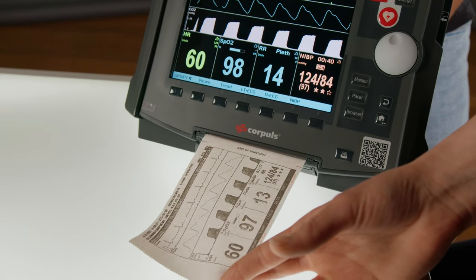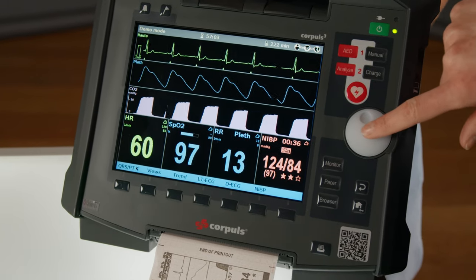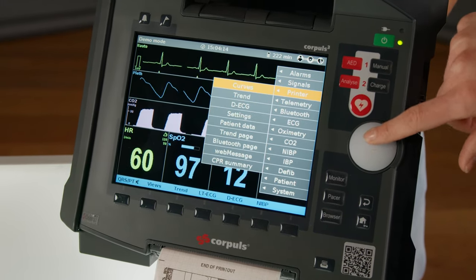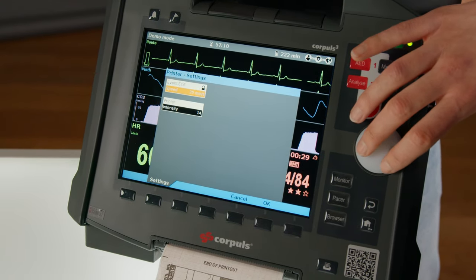If the intensity of the printout is too low or too high, you can change it. To do so, go to the menu, select Printer, Settings, Intensity. And here you can change it up and down.